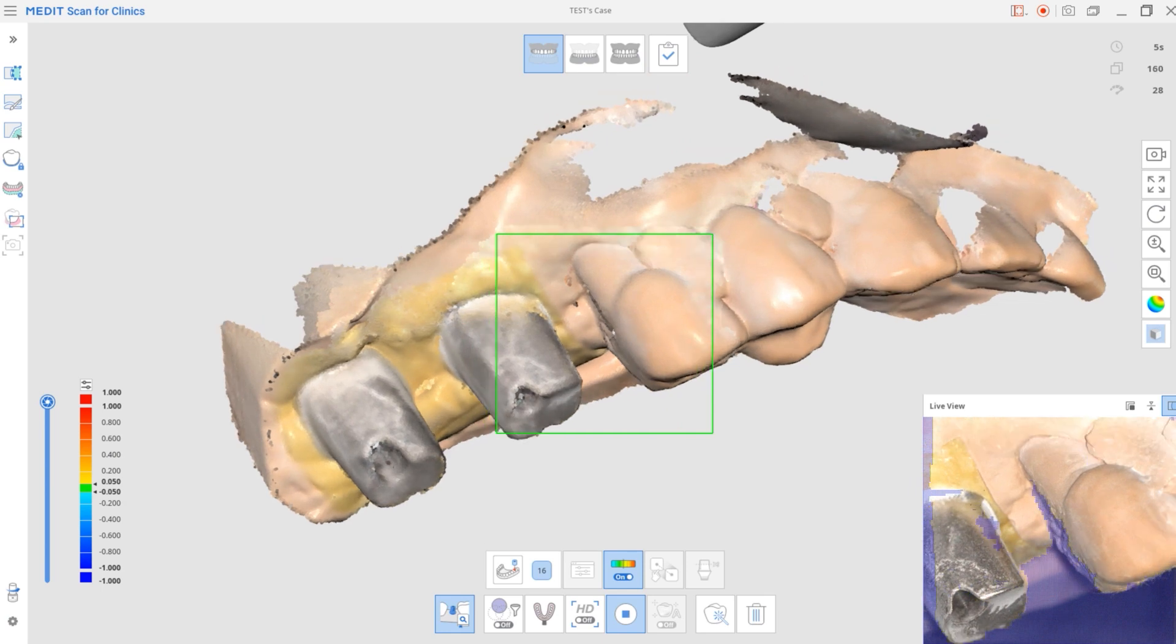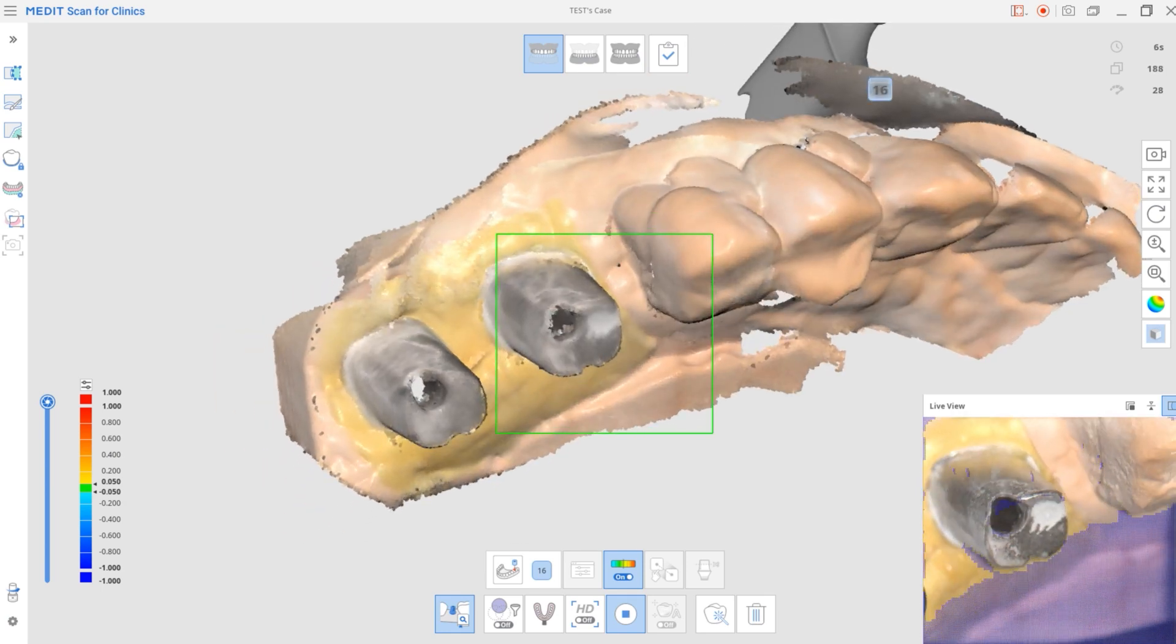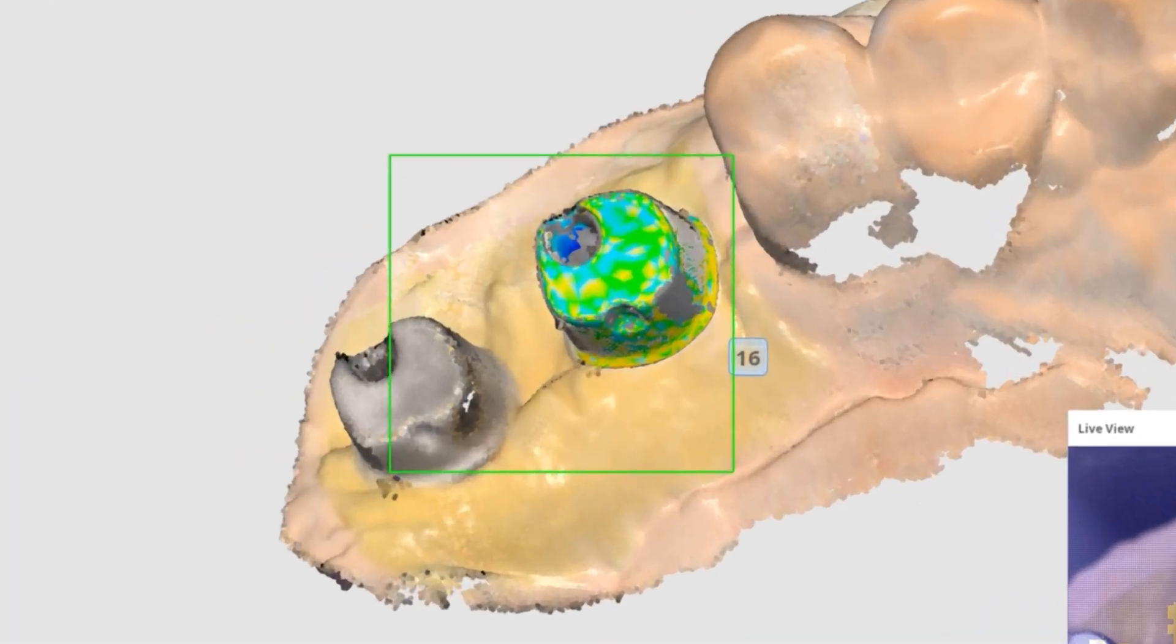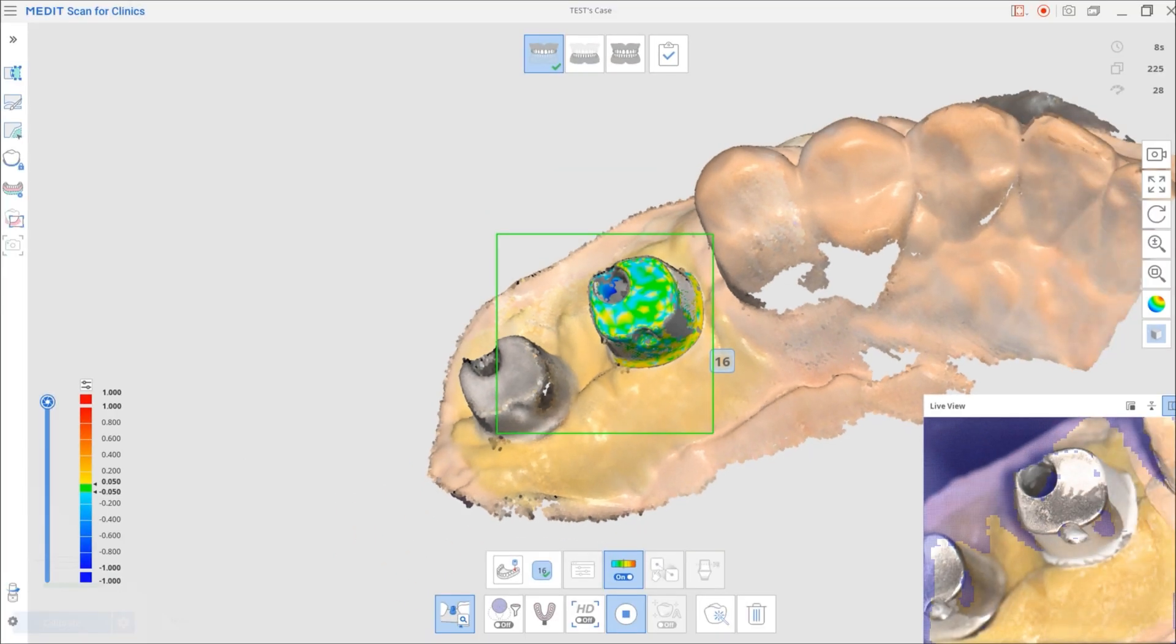The abutment will align once enough information has been captured. As you can see, when you have gathered enough data, they will be automatically aligned.